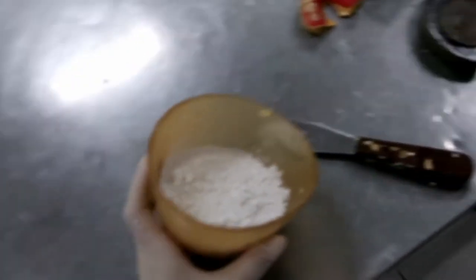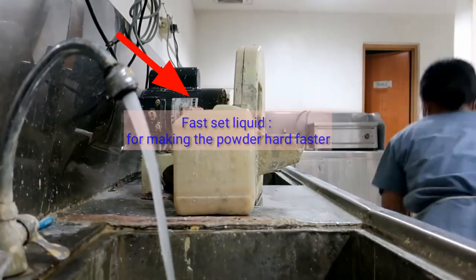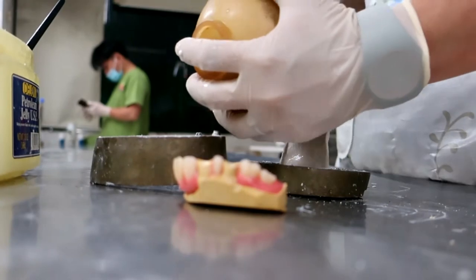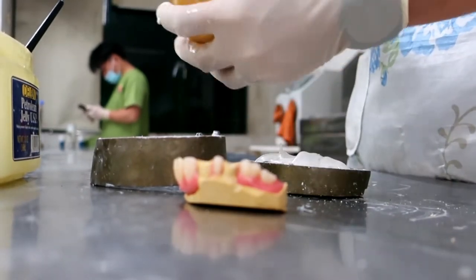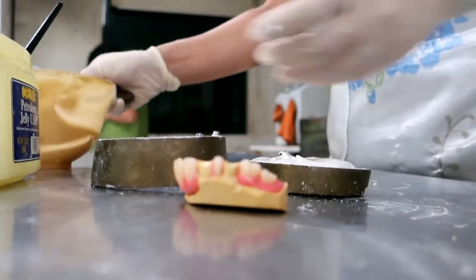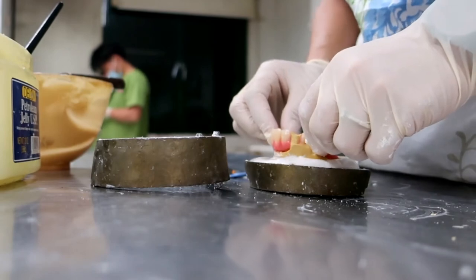This is the amount of plaster of Paris I'm going to put for the base. First I pour the plaster into the half of the flask, then put the cast on it and press it slightly.